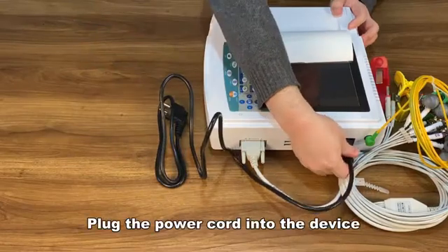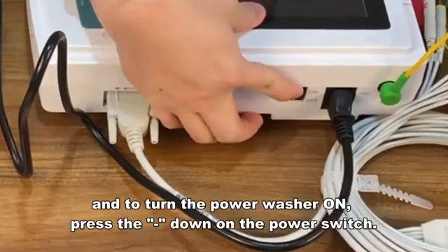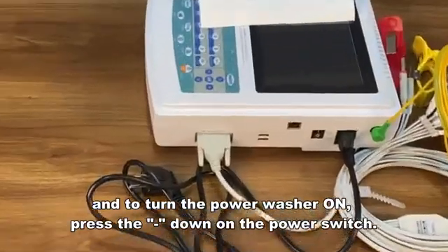Plug the power cord into the device. To turn the power on, press down on the power switch.